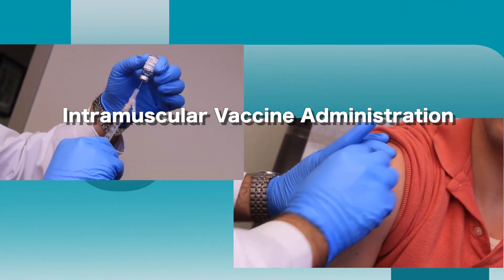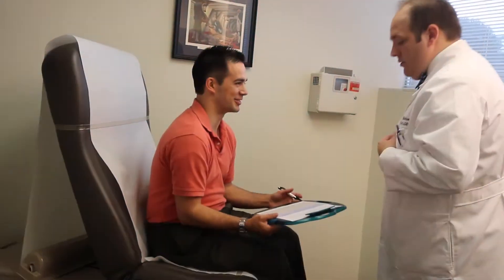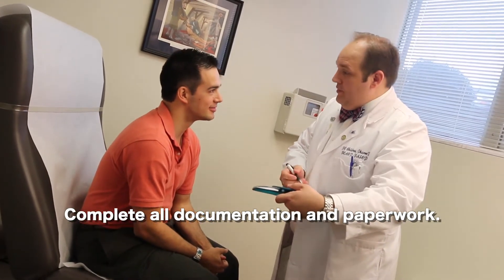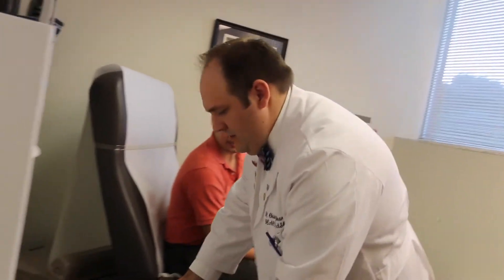Intramuscular injections are most commonly given in the deltoid muscle of the upper arm. The first step to administering an intramuscular vaccine is to complete all paperwork and consent forms. You never want to administer a vaccine without having consent forms completely filled out and documented.